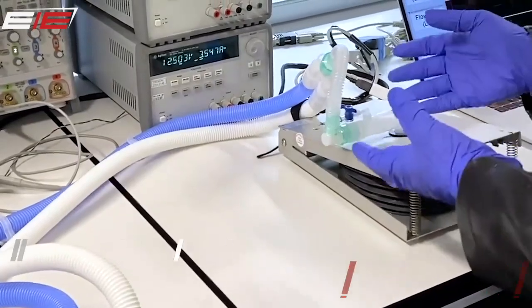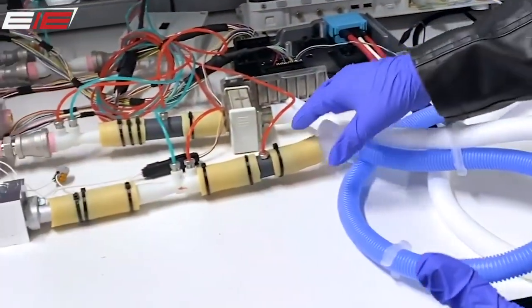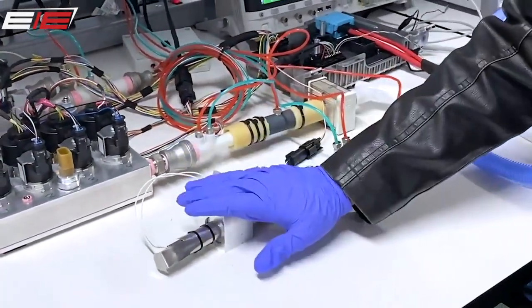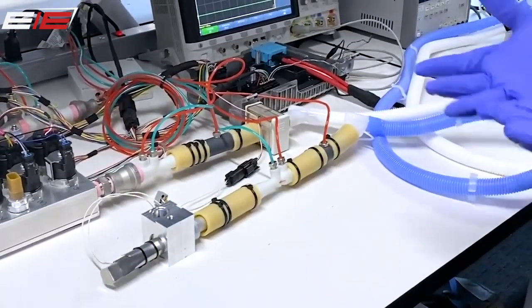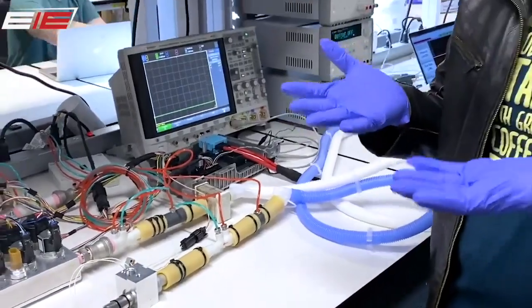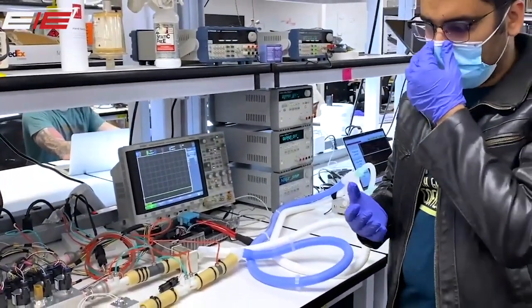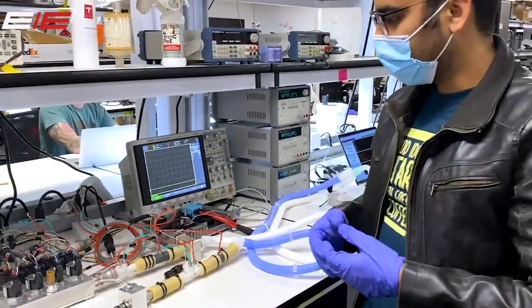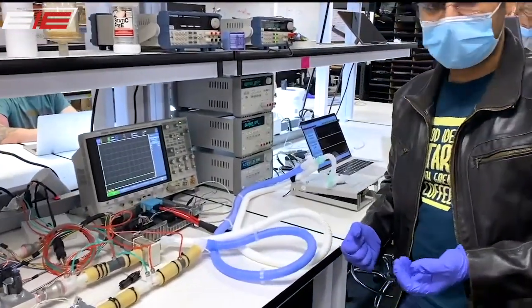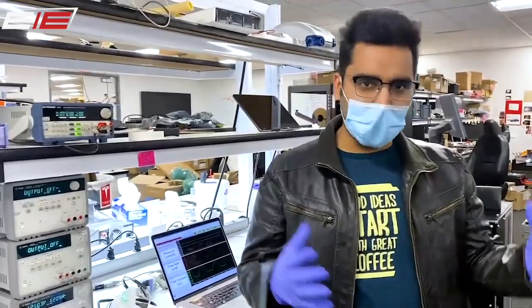And then carbon dioxide is put into that air and it goes through the exhale pipes, through a set of sensors, and then through the exhale valve, which is used to throttle the pressure of the lungs. So you always keep a positive pressure on the lung, which helps the COVID-19 patients to breathe and keeps their lungs open. So that's the Tesla ventilator first prototype. And now I'm gonna put you over to Ben, who's gonna show you the packaged version of the same.